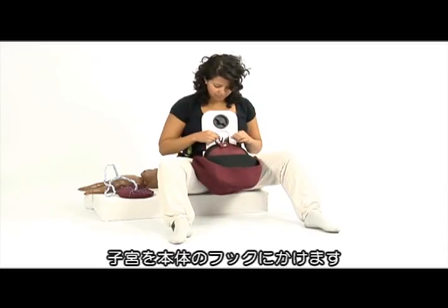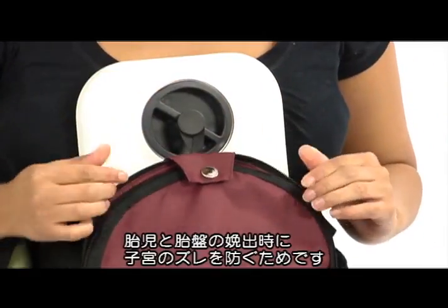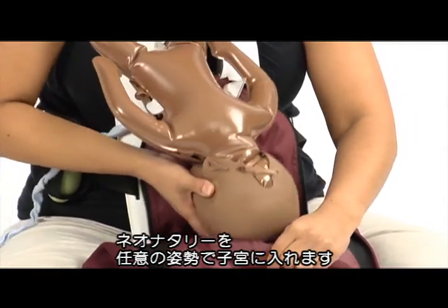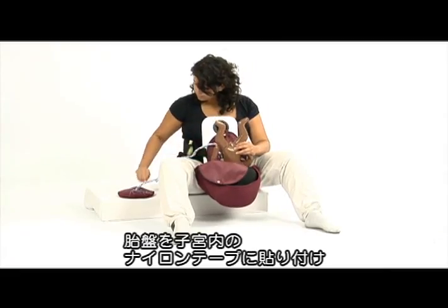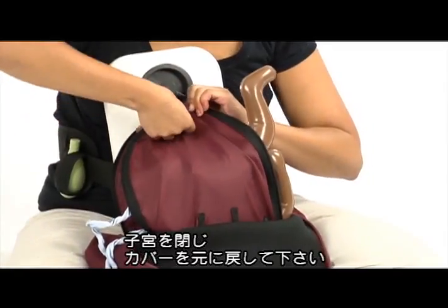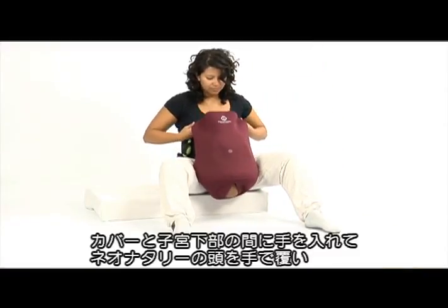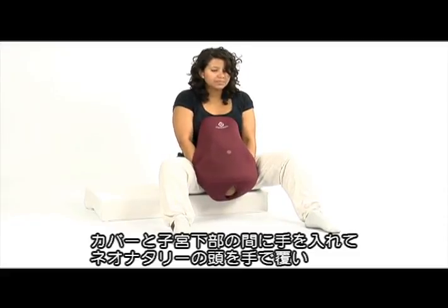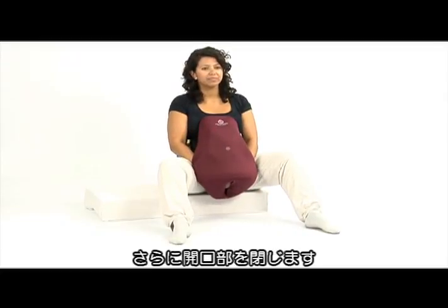Fold the stomach down and hang the uterus over the hook. This will keep the uterus in place when delivering Neo Natalie and the placenta. Open the uterus and insert Neo Natalie in the desired position. Attach the placenta to the Velcro located inside the uterus. Close the uterus and pull the stomach skin back to cover the skeleton. To hide Neo Natalie's head from the birth opening, place your hands between the stomach skin and the lower part of the uterus bag, hold your hands around Neo Natalie's head and clamp the birth opening together.